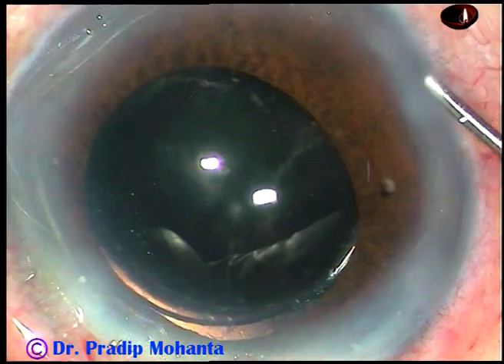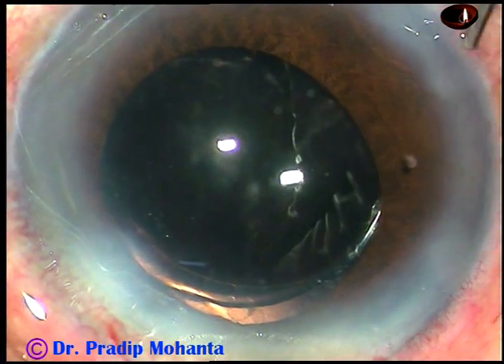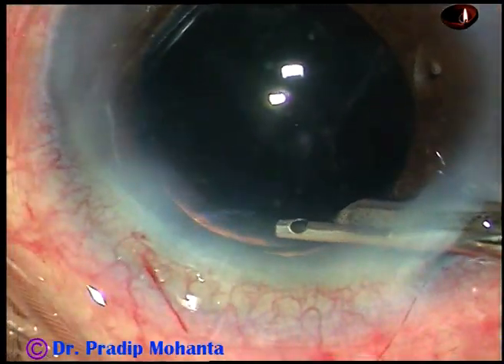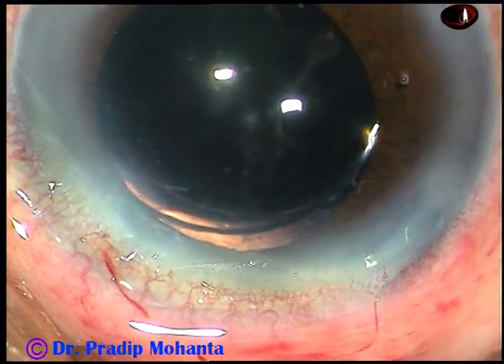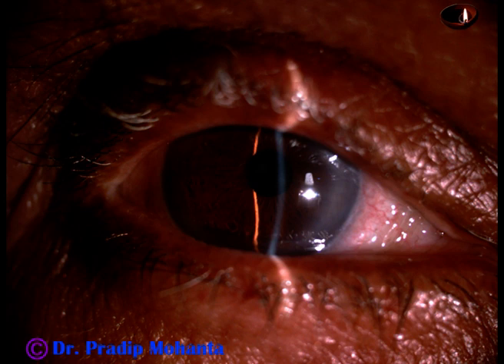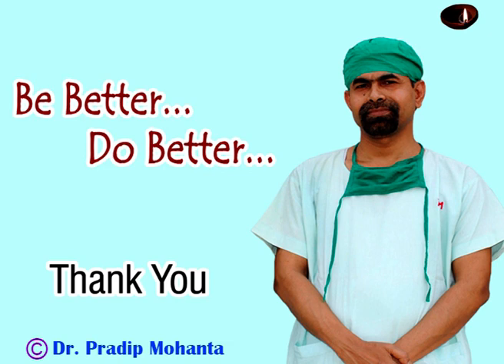Now I clean the cortex and viscoelastic substance, hydrate the side ports so the paracentesis openings close, and after a final lavage the anterior chamber is formed nicely with a Simcoe cannula. The case is concluded after checking the wounds — there should not be any leakage from any side. This is the first post-operative day follow-up after about 18 hours — see, there is no corneal edema. Thank you very much for watching; I hope this video will help you in developing your surgical skills.